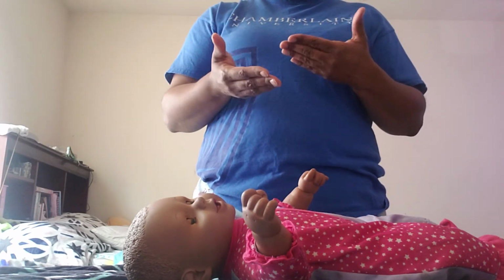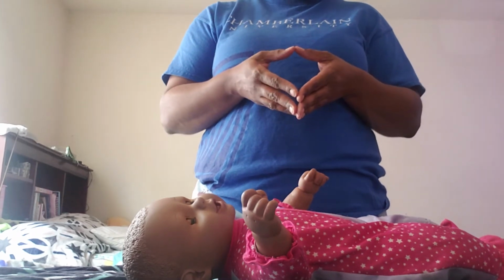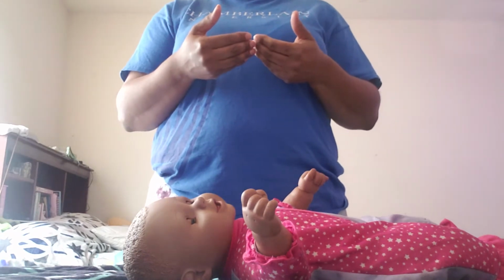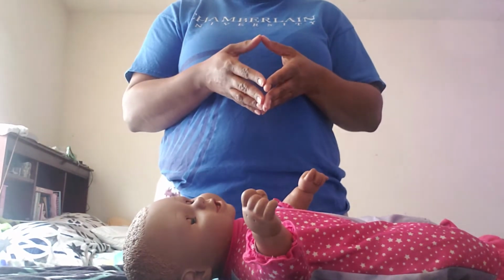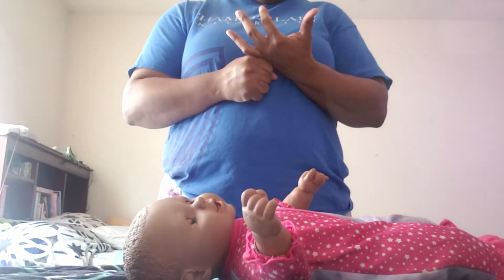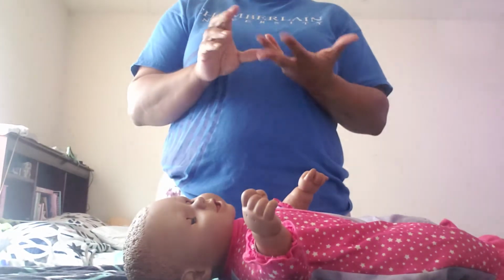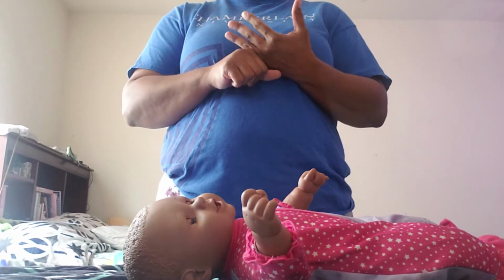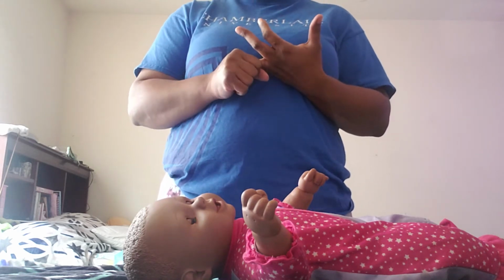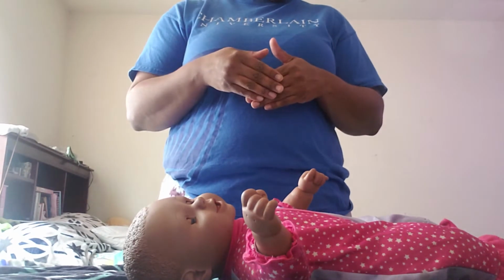I wanted to make sure that you didn't have any questions, or if you had any questions, that I'll go ahead and answer those for you. Is it okay if I go ahead and do the NG tube insertion? Okay, great. Are you in any pain right now? Do you have any nausea? Do you have any vomiting? Patient states they have a pain level of 4 out of 10 and a little bit of nausea, so we'll go ahead and give the patient some pain medication to ease the pain.